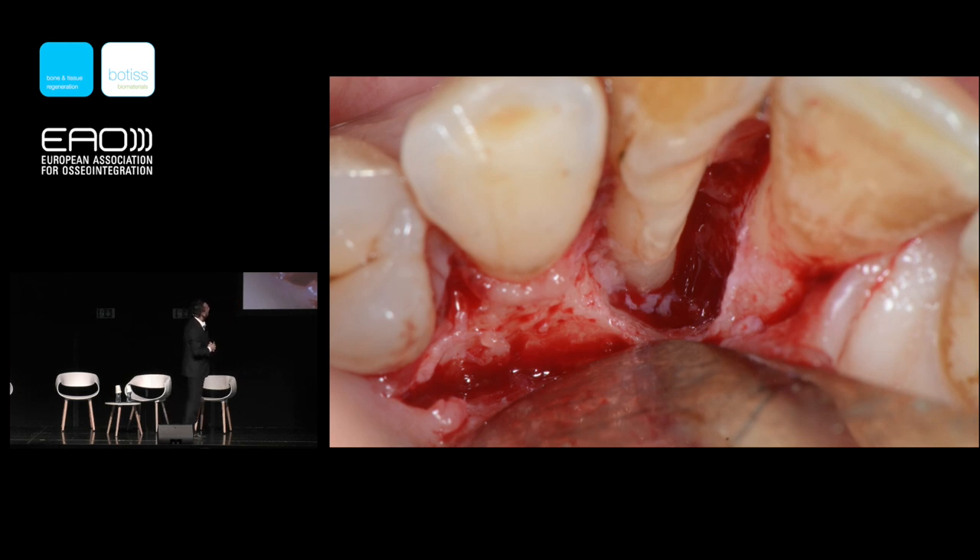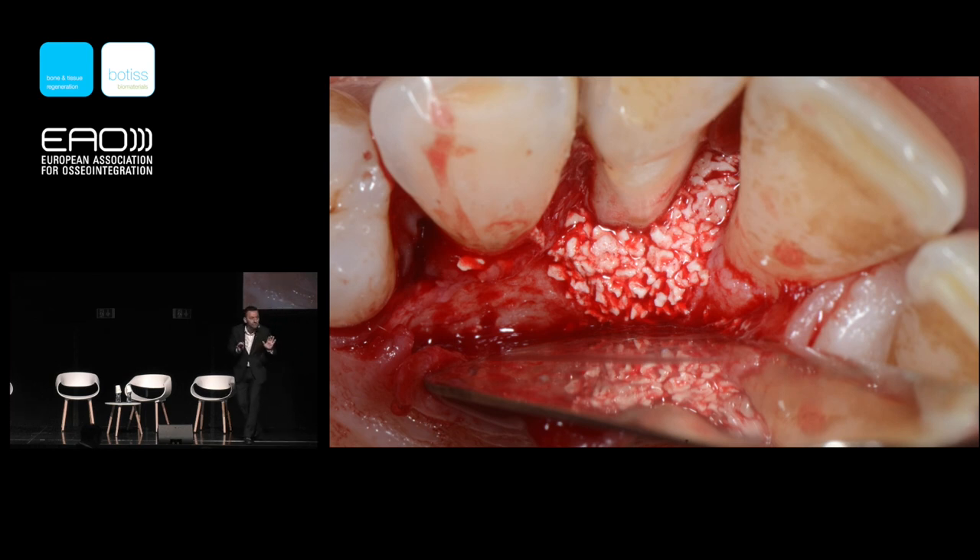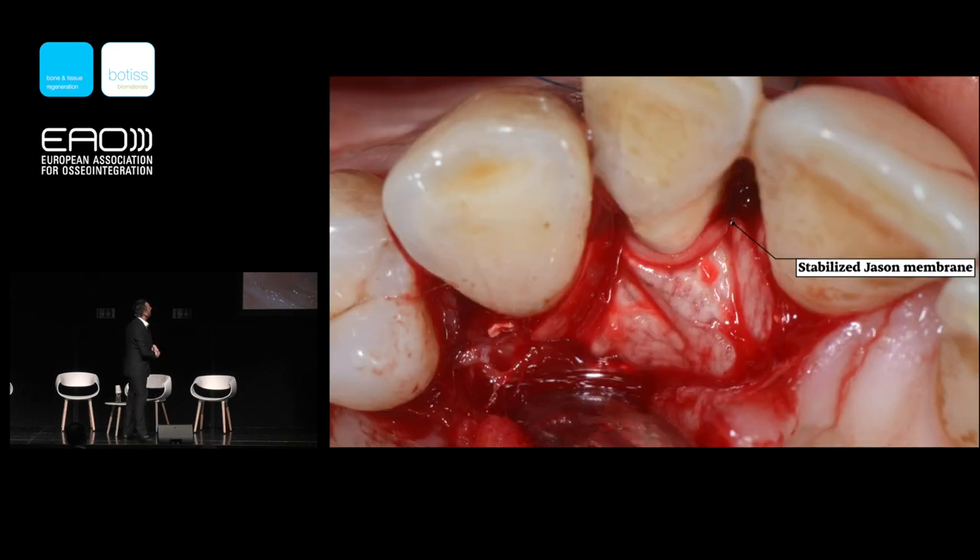I make a large palatal flap to see the developmental groove causing this periodontal destruction. I removed the granulation tissue from the defect without any vertical releasing incisions, because the palatal anatomy gives me the opportunity to reflect the flap only with papillary incisions. I will apply this novel biomaterial — the xenograft Cerabone enhanced with hyaluronic acid — to attract more cells into the area and increase the rate of healing. We don't want to overfill the defect; we cannot compete over biology.